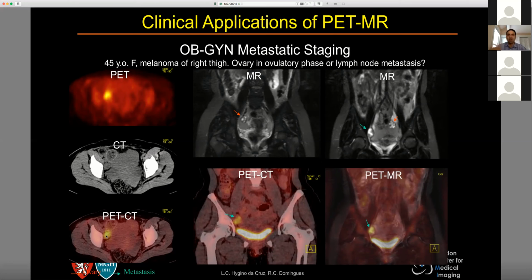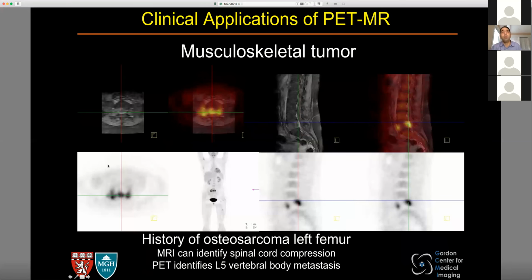So that gives you a sense of the improvement in image soft tissue contrast. Look at this versus this. All right. That's one piece of gain. And you can apply this to multiple applications. I'm not going to go to all of them now because we will have a session with Thomas Eng talking about the clinical applications.